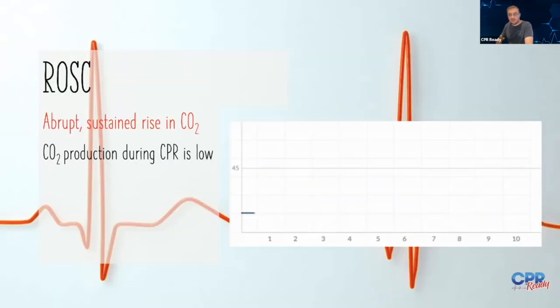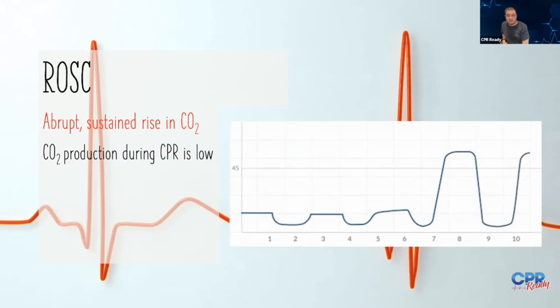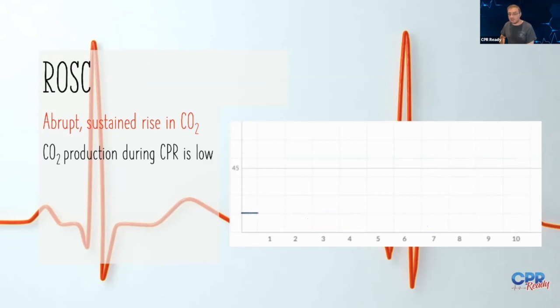And so as we're talking about resuscitation during CPR, your compressions take the place of the heart, right? But even the best chest compressions only produce about 20% of that heart's normal output. So remember from the last slide that we just looked at about hyperventilation, lower CO2 levels could be related to poor perfusion. But say we got low CO2 levels because we're in that low flow, low perfusion state, and then suddenly we get a spike like this, and we get this abrupt rise.